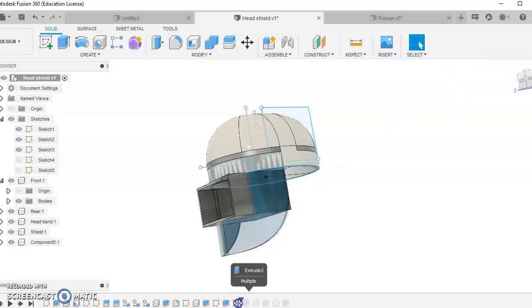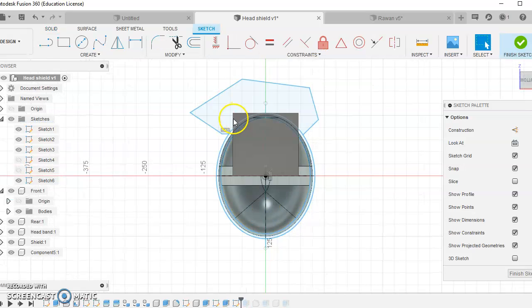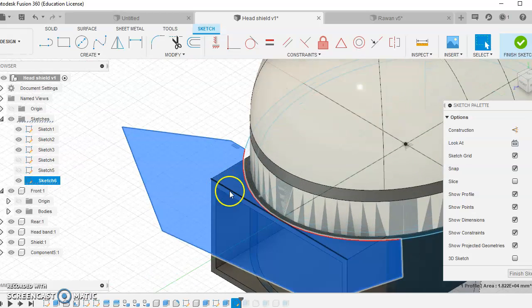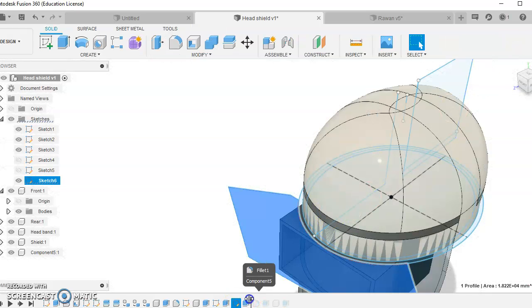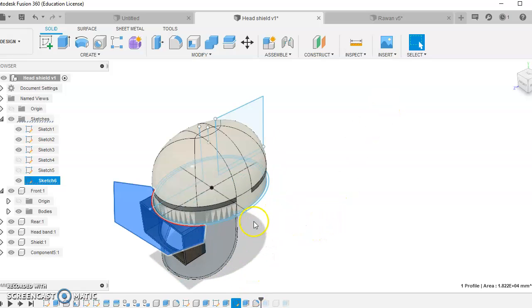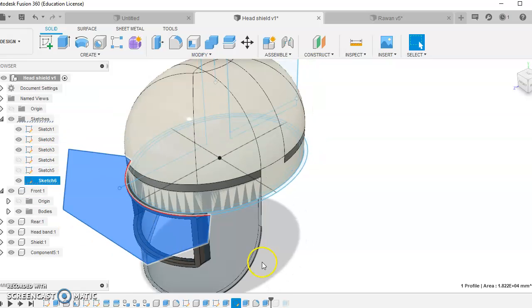So on the next part of my window, you can see what I've done here. I've created a shape, and I've cut these little corners off here. Let me show you in more detail. There's this bit here that's going to be removed. So it's going to cut away that corner piece there that we don't need anymore. Right? And it would then look like this. I would then put a radius on the edges here, just to round that off. And you can see now that this has started to develop quite nicely.